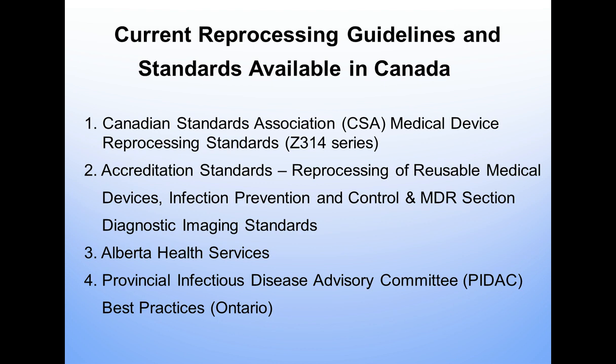And then the accreditation standards are written based on the CSA standards, and there's also a specific standard on reusable medical devices reprocessing. In the infection prevention control standard, there is a section on the medical device reprocessing standards clauses, and there's also an MDR section in the diagnostic imaging standards.